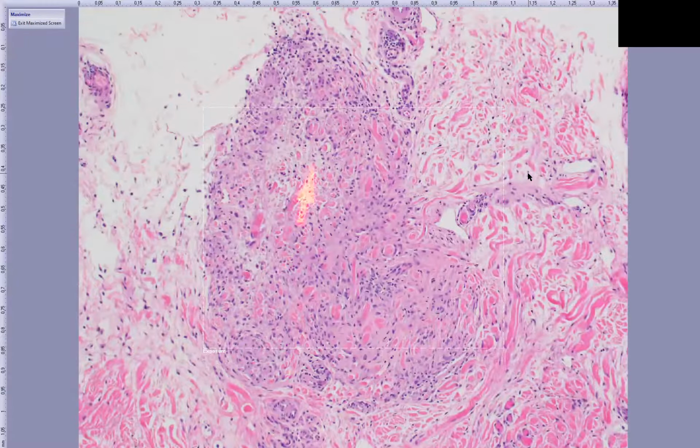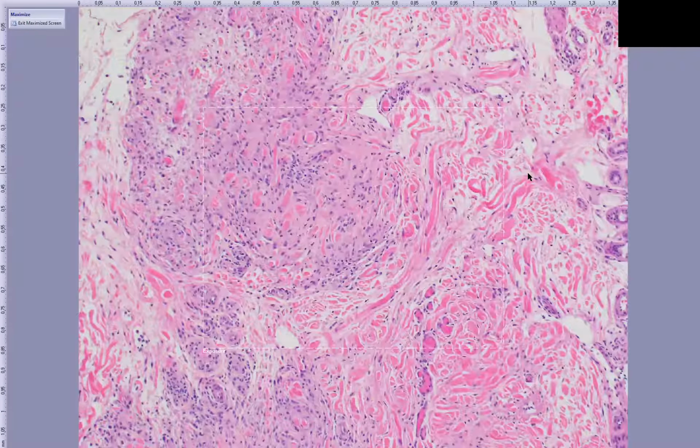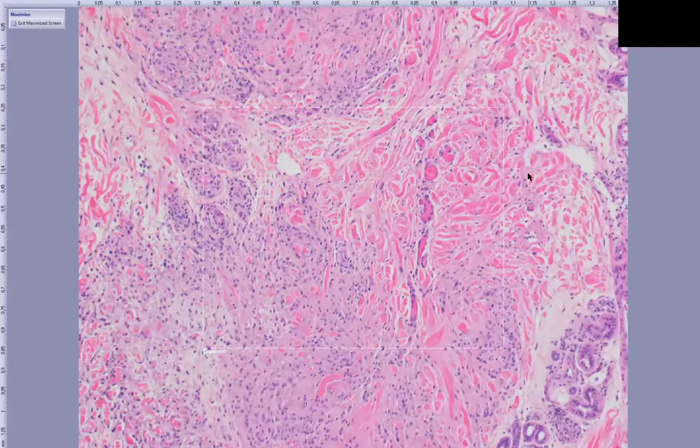There's another zone there. So in granuloma annulare, the epidermis is normal because the activity is really happening in the upper to mid-dermis. You don't have a linear arrangement of the epithelioid histiocytes. They're organized as palisades versus in necrobiosis lipoidica, we talked about the horizontal arrangement of the histiocytes.